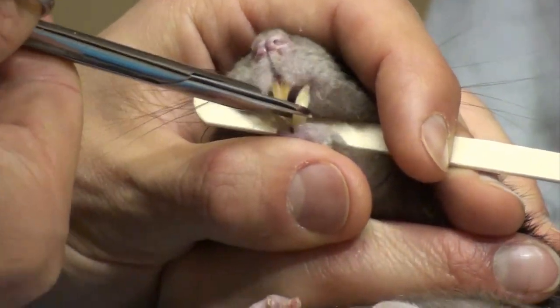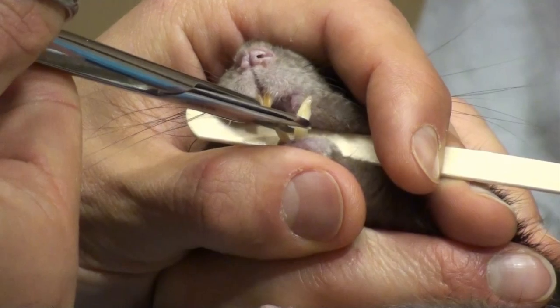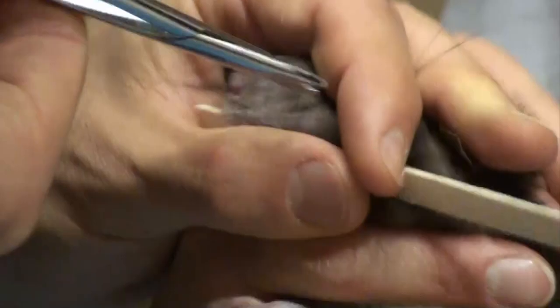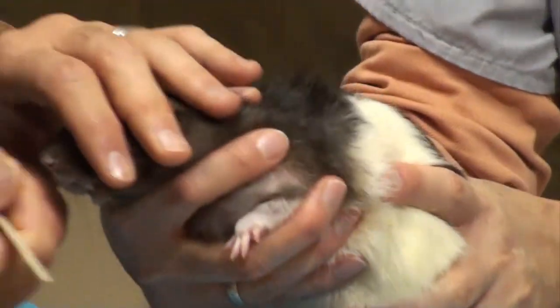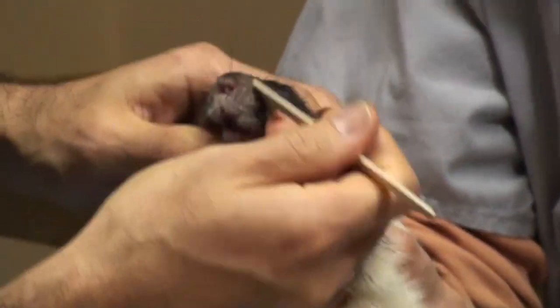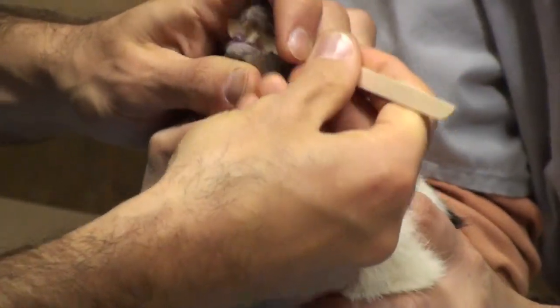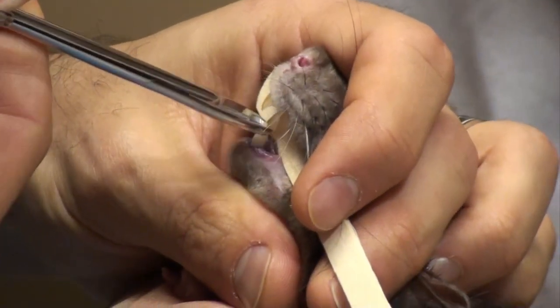I'm going to trim this tooth here. I'll give him a break, then continue — placing the tongue depressor back in behind the teeth to guard the other mouth structures. Now I'm going to trim the lower teeth on this side and then give him another break.